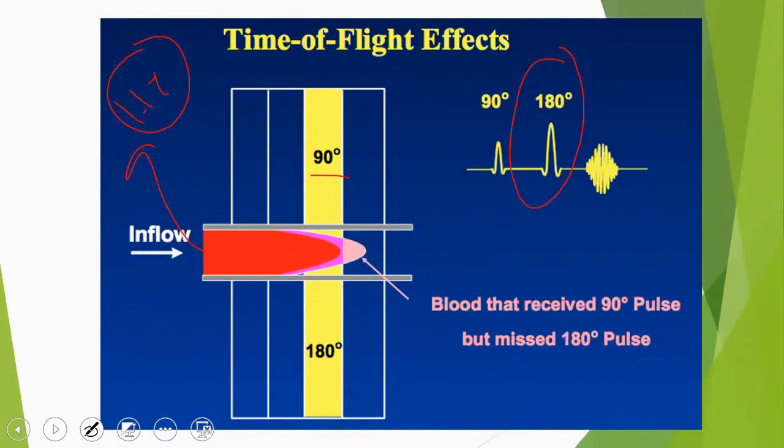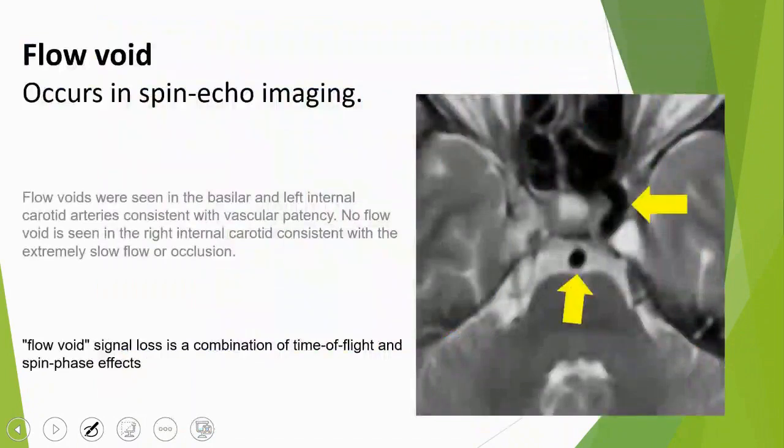If, for example, I am imaging a T2 image, I want to work on transverse magnetization to give it a 180-degree pulse. But will I find the initial red blood cells, RBCs, present or not? They are not there. So will the new entry be affected? Will it give me a signal? What will its signal be? It won't give me a signal at all. That's what will happen, which is why the image appears this way.